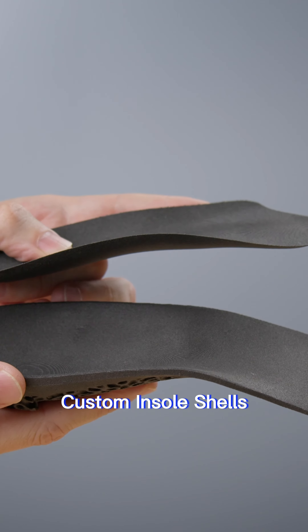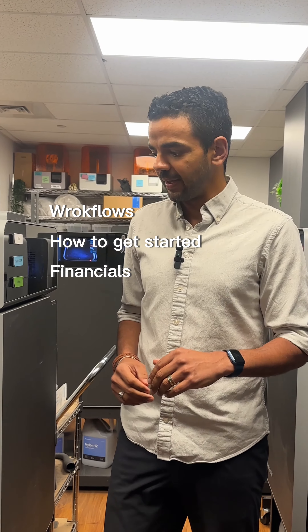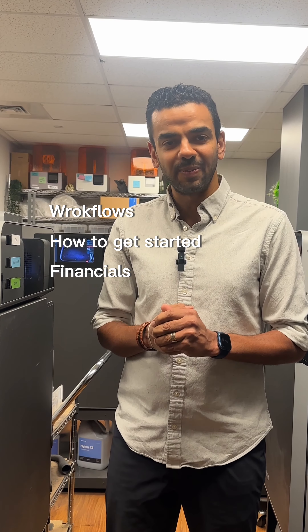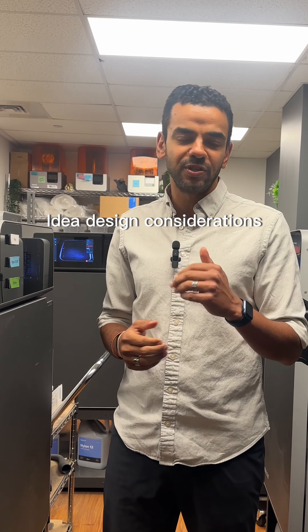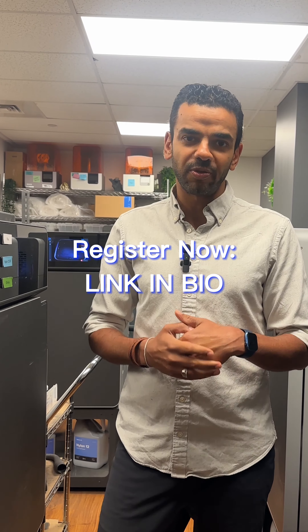We'll be learning about workflows, how to get started, and a bit on the financials as well. You'll also hear from two of my colleagues talking about ideal design considerations and other details you need to get up and running with 3D printing.